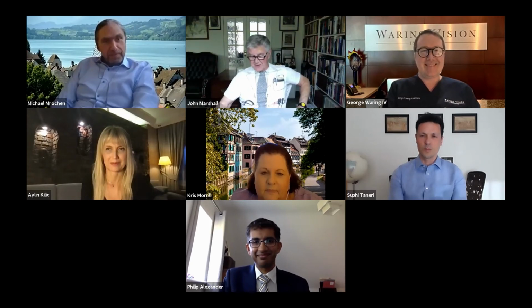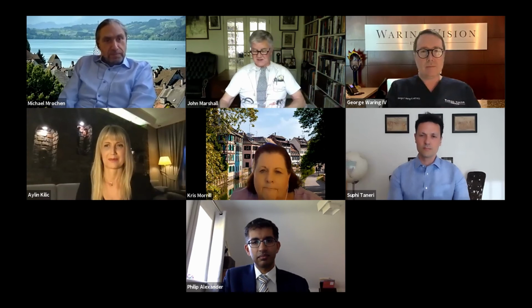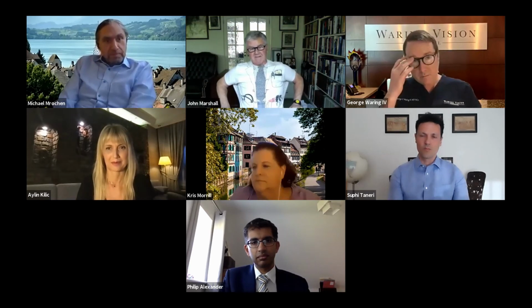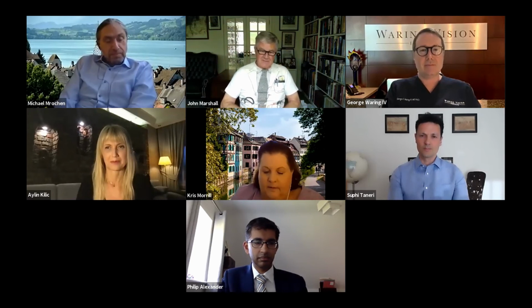I'd like to go a little bit further into, and frankly I'm really interested in, the development in lenses over the years. What has slightly frightened me is the degree of development in different companies with different focal zones and different principles in terms of giving me click stops for vision. So I lose my accommodatory, beautiful evolutionary system, and I end up with a series of click stops in terms of the different lenses. And I have to say that I haven't yet seen any of that technology that I would find attractive. At the moment, I'm 2 years off 80. When I need my cataract procedure, I think I'm still going for a straight sphere with the blue blocker. And I just wondered where you are in relation to the huge technology, and which one you would advise me to have if you could convince me.